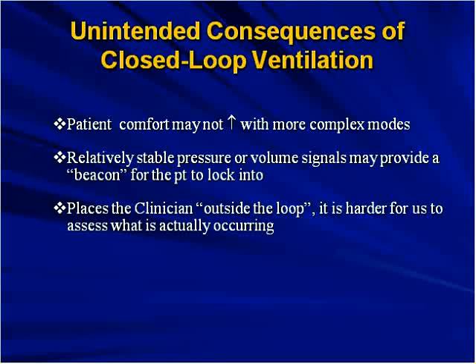Okay, so in terms of ventilator settings, auto PEEP is essentially a tidal volume that is too large for the expiratory time that the patient has. So in other words, when you have obstructive lung disease, it takes a lot longer to equilibrate, or to exhale your tidal volume. So you're dealing with the resistance of the circuit, the amount of PEEP you have on, the size of the endotracheal tube, if there's bronchoconstriction or mucus.